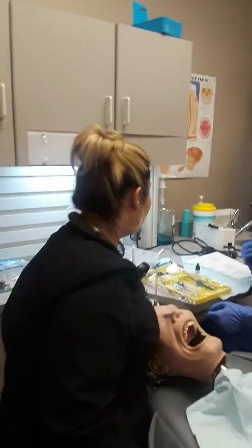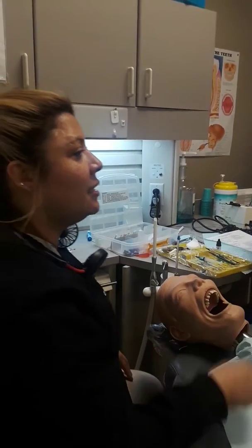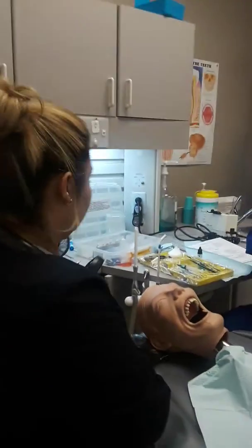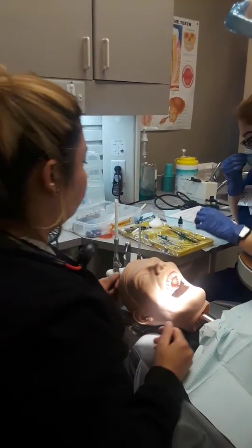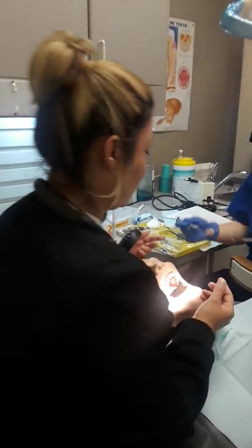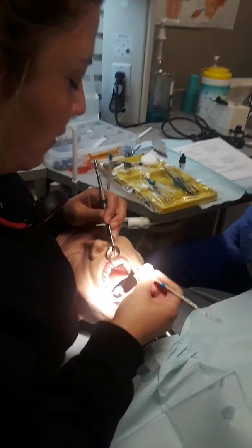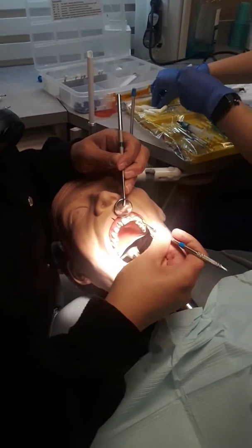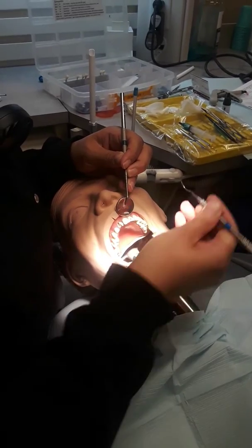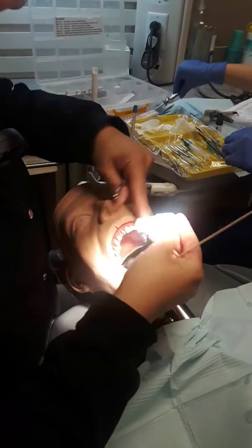Okay, do you have your procedure sheet? Step one: basic pass. We're doing our basic pass, which is just verifying we're working on the correct tooth and it needs the treatment planned. We're going to work on number 10, MF — it has a little L in there as well, so MFL.